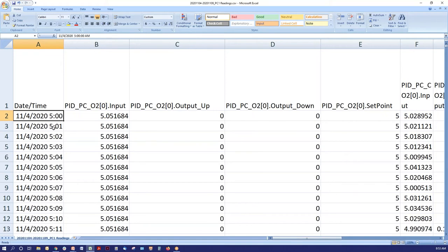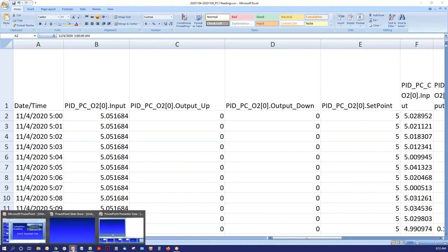If I exported that data at 5-second intervals, it would be much, much larger. And if you go to, so if you export too many days, oh, I'm getting ahead of my slides. Let's go back to the slides.